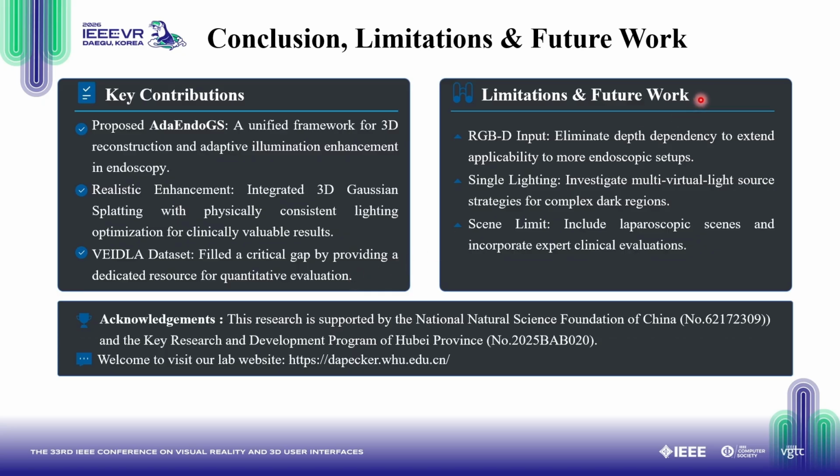For limitations existing in our method, our future goals are listed here. RGBD dependency: we currently need depth data, and we want to extend to RGB-only input. Single virtual light: our current strategy works for major dark regions, and we'll develop multi-light strategies for scattered complex dark areas. Scene limitation: VEIDLA focuses on colonoscopy. We are trying to expand to laparoscopic scenes and add clinical expert evaluations.